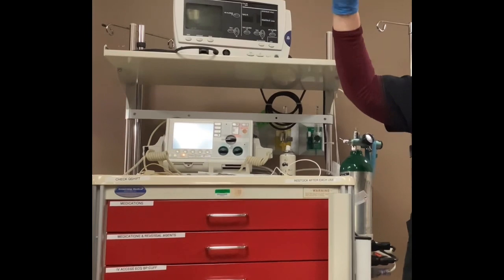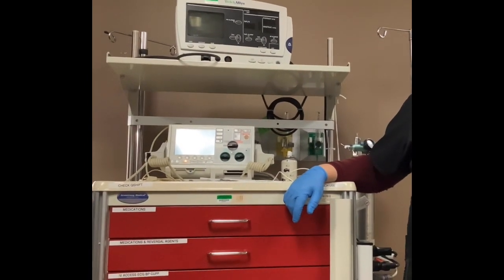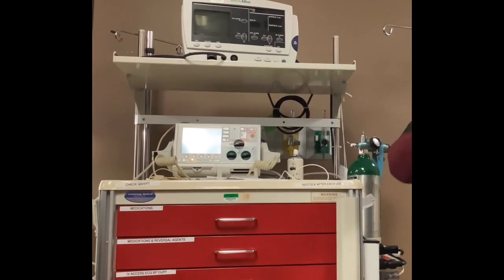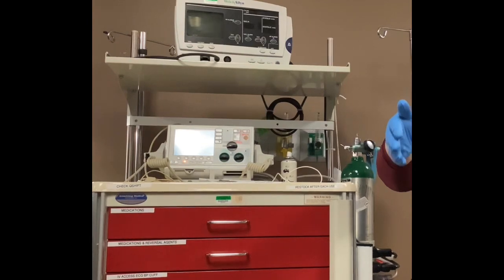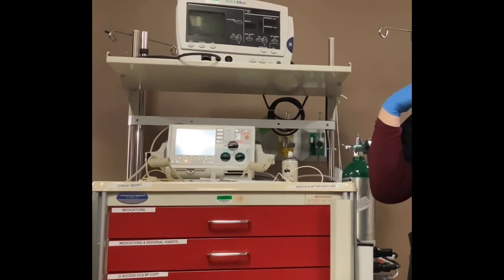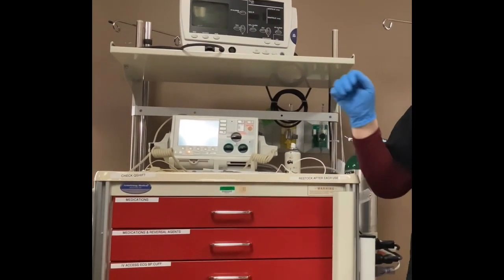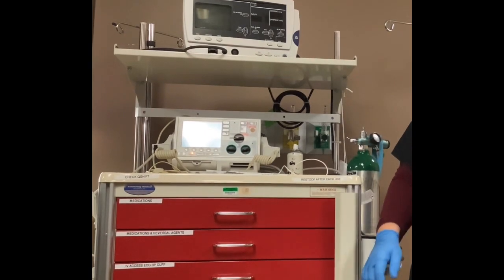Okay? Who had a question back there? Somebody? No? Oh, yeah. It's also in joules, right? Yes, joules. And you said sync, what does that mean? There's a patient who has a heartbeat. In order to not mess up that heartbeat and throw it into VFib or something like that, you can't just give the shock at any point when someone has a heartbeat. You want to sync it to when it's on the QRS. That's the right time to do the shock. When you sync it, you're saying sync to that and make sure you shock appropriately, because the patient does have a pulse. All we want to do is stop that abnormal rhythm and have it go back into a normal rhythm. With VFib or VTAC, there's nothing to sync to, because it's all waves and there's no QRS. It's a room full of people and you're trying to get it to stop. We need it to get back into normal.